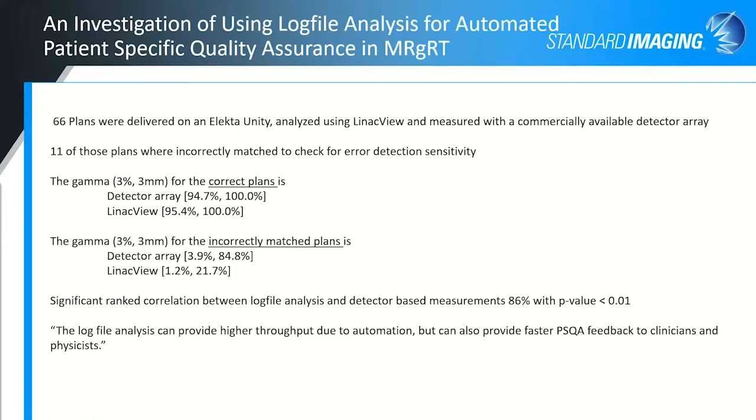And so each day of the treatment session, there is a new plan. There was some concern by the individuals that investigated: how do we know if today's plan is really the plan being delivered? And so that's where this investigation came in. So that's what I mean by incorrectly matched plan.